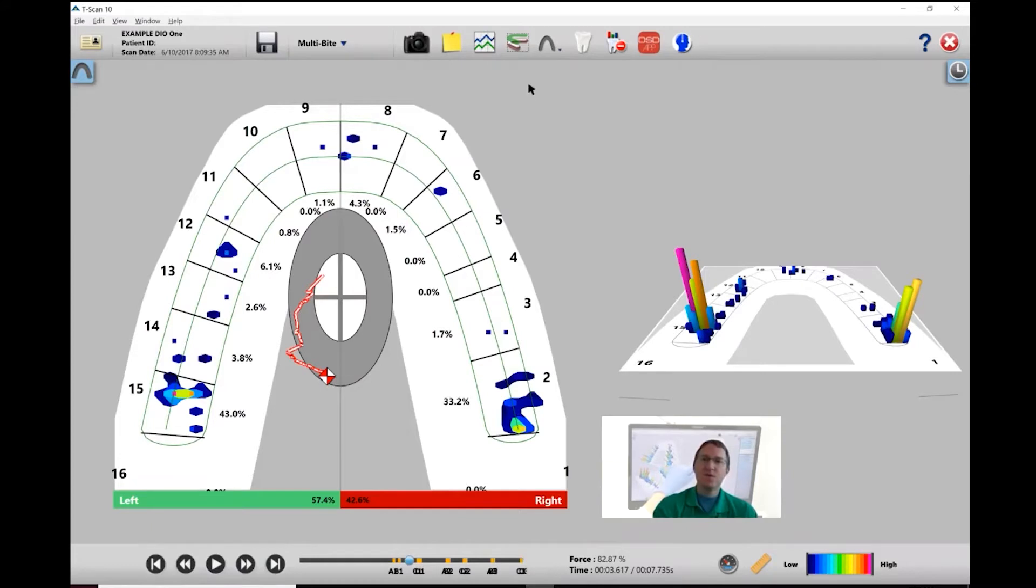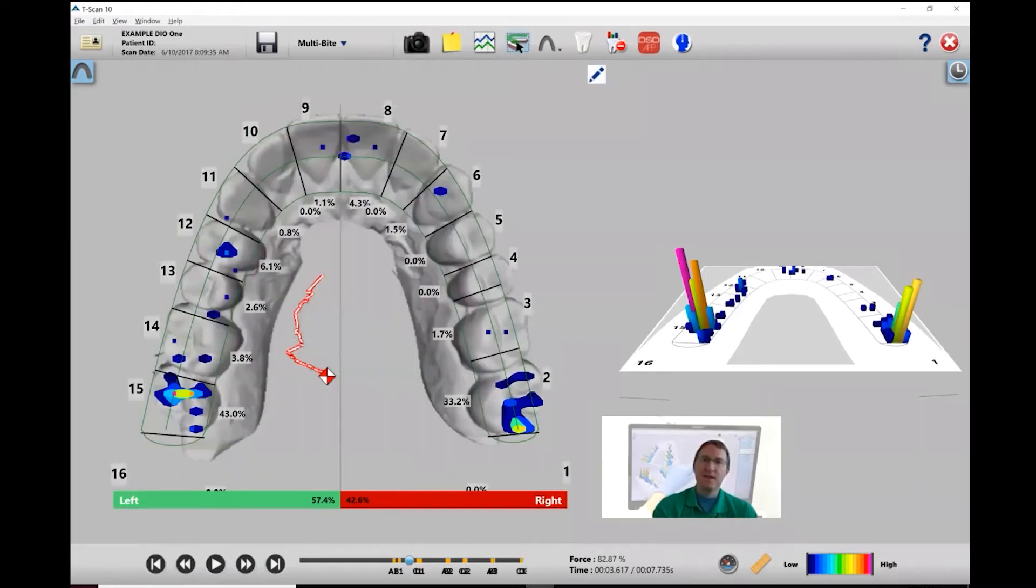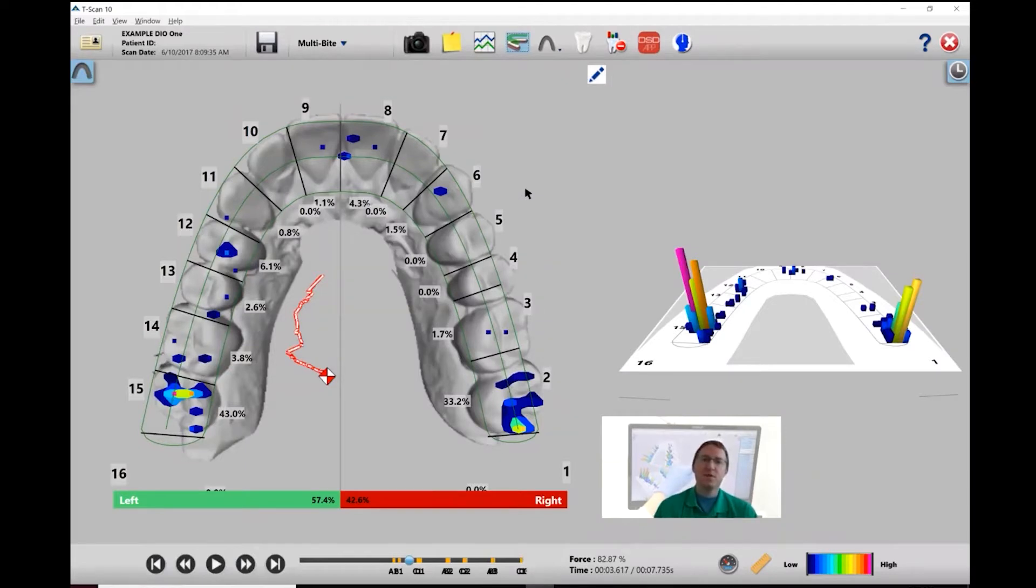The first thing we're going to do is go up to the digital impression icon and left-click. You can see that the T-Scan software imports the digital impression into the 2D view.